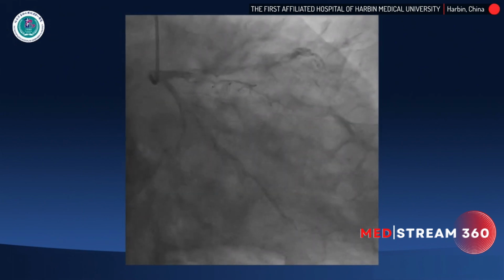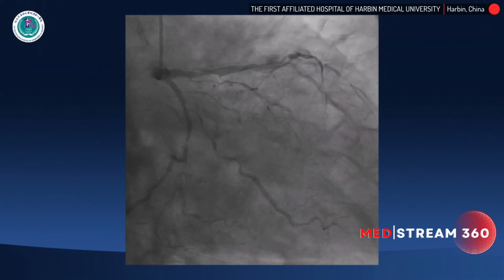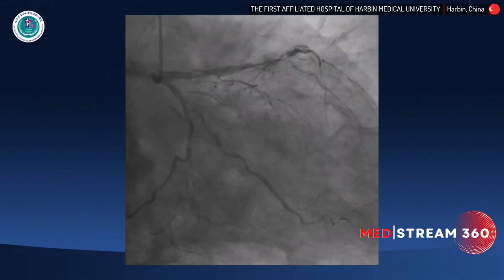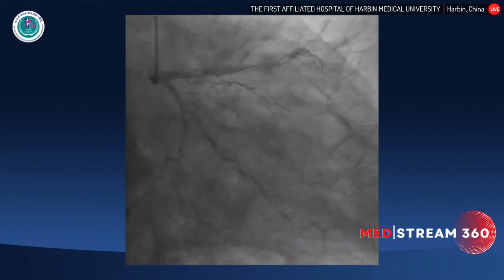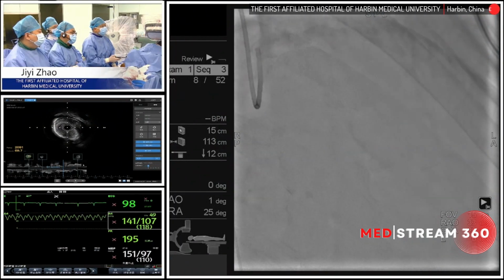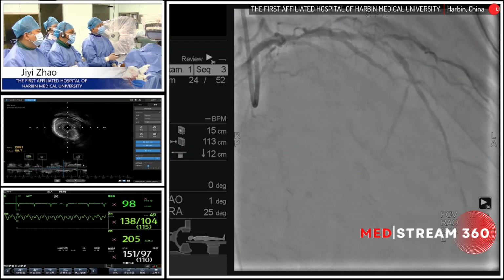This is the angiography today. We can see serious stenosis in the proximal OM and the distal LCX. We can see severe stenosis and calcification in the proximal LAD. So his lesion is complex. The distal LAD vessel size is too small, so it is not fit for CABG.